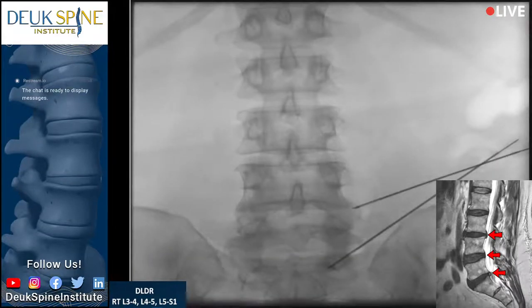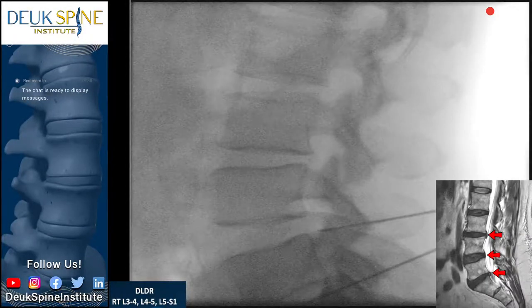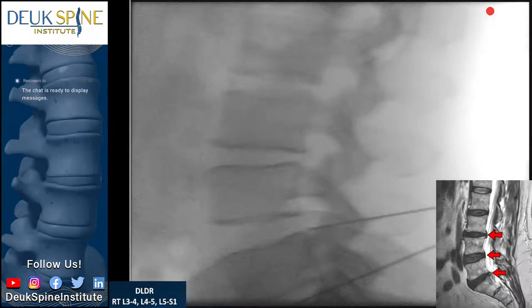All right, so we're just outside the herniated disc at this point. You can see the facet joint is a bit enlarged from arthritis, right where the tip of the needle is. All right, I'm happy with the positioning here. So we're gonna enter this L4-5 disc pretty low.